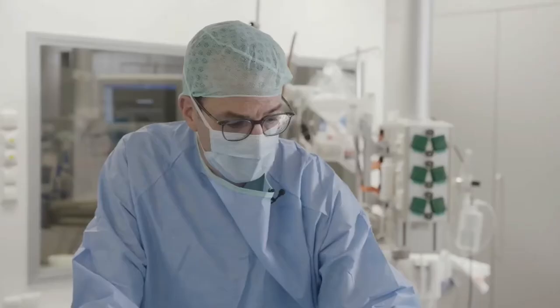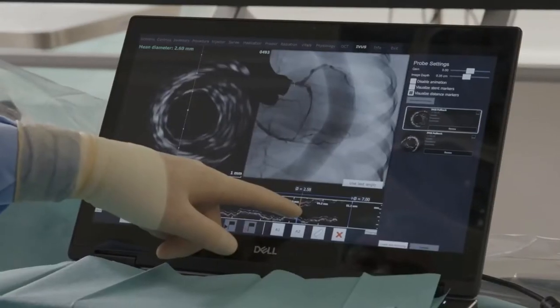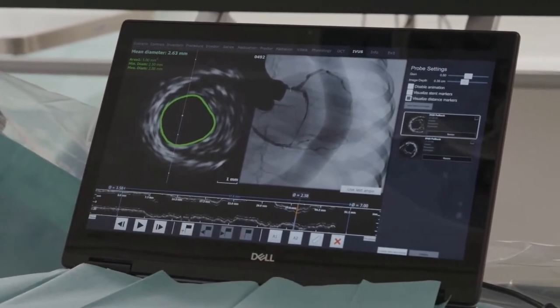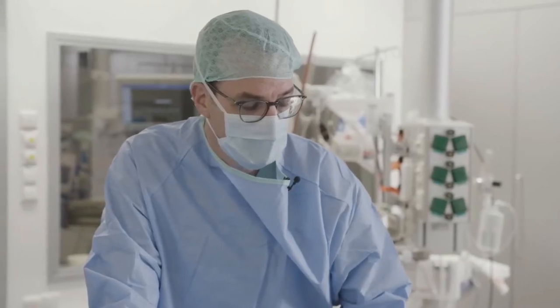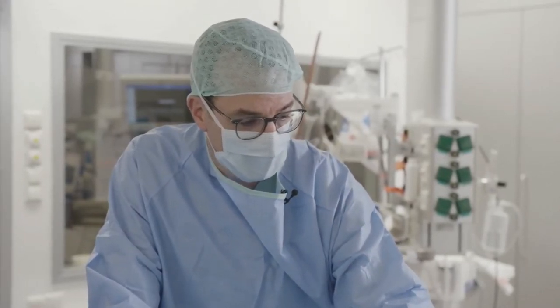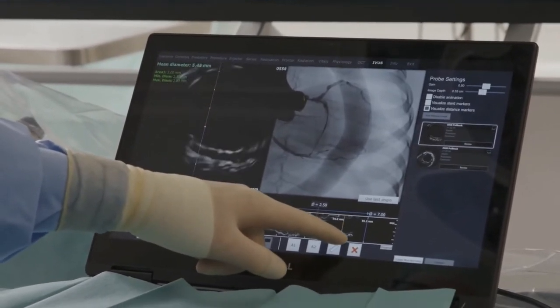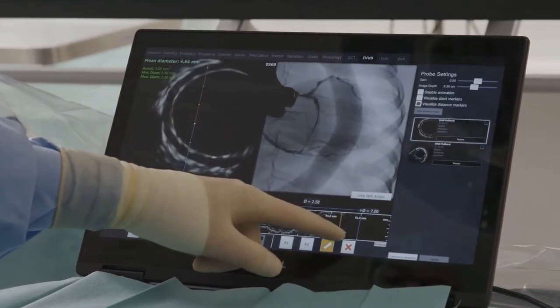This is the tight stenosis in the left main, which is here measured with an MLA of 5 square millimeters, which is clearly below 6. And then we go to the ostium of the left main, which is clearly normal.